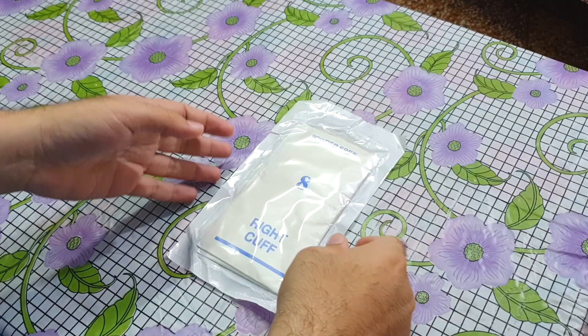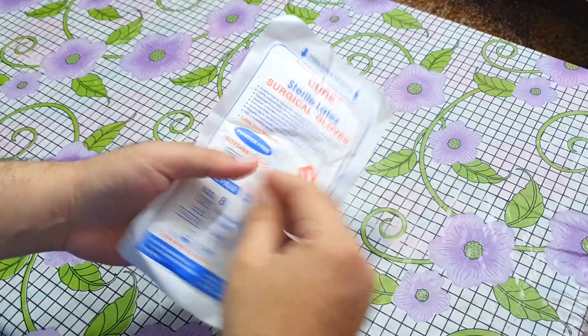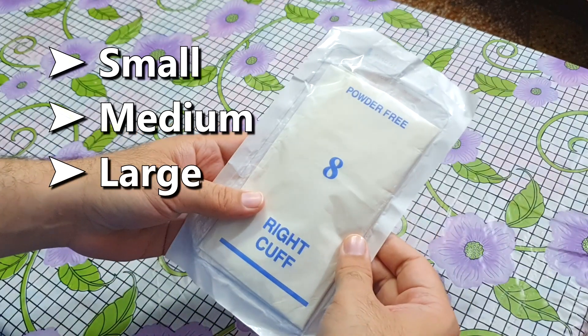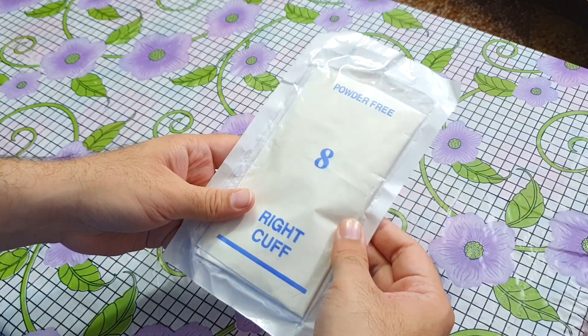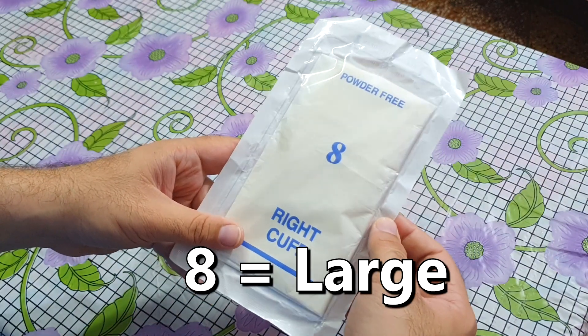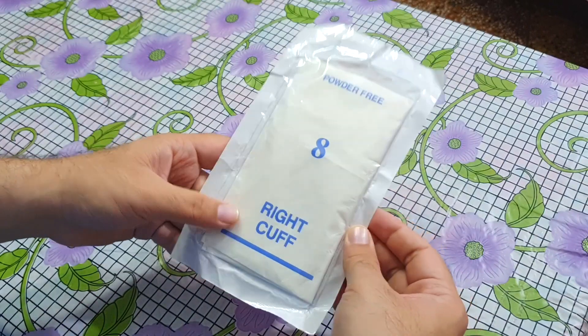These are the sterile surgical gloves — you can see they are packed in a sealed packet and are not open. They come in different sizes like small, medium, large, etc., which is mentioned on the packet. In case of these gloves the size is mentioned in the form of a number; this size 8 corresponds to large size. You can select the size of gloves for yourself according to the size of your hands.